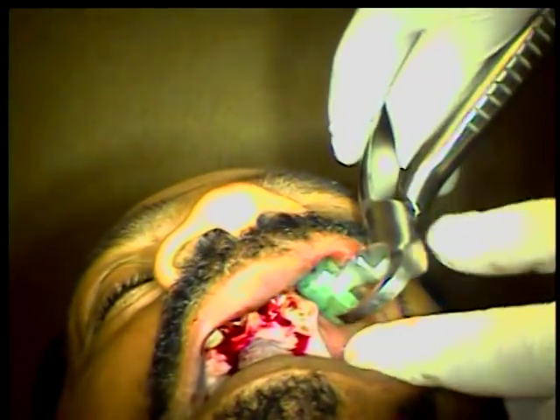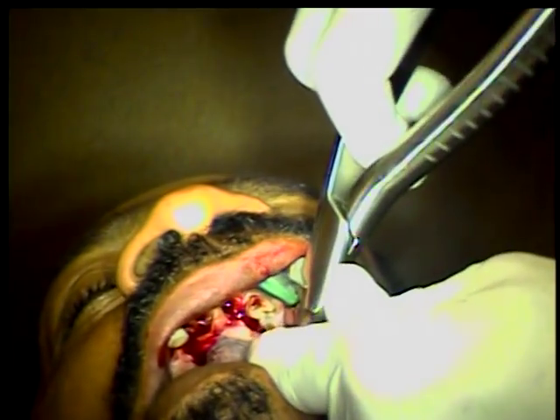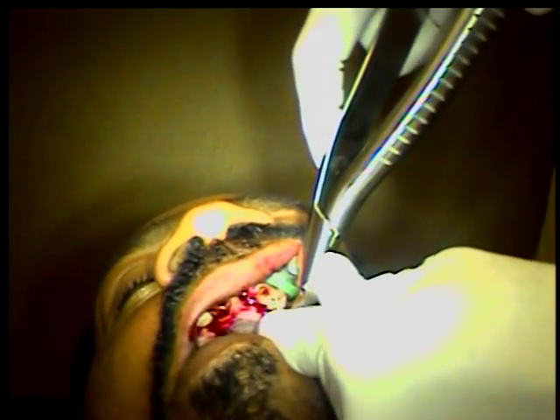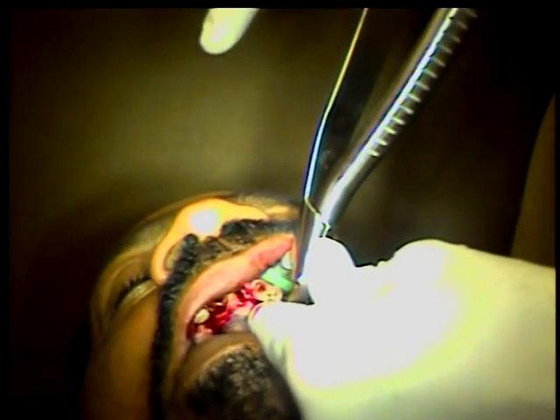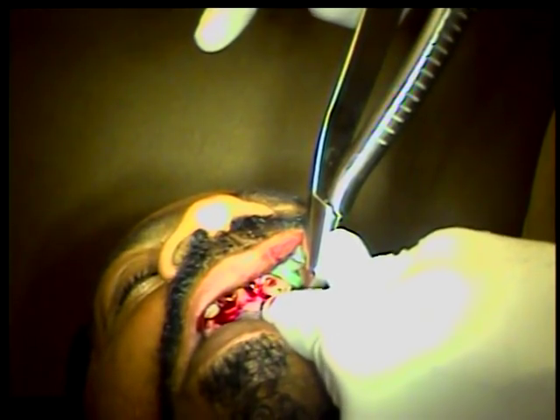Let's go to number twelve — same thing. Push down. I can use two fingers on this too, because I'm bracing the beak with my other hand. I'm using two fingers. All my wrist. The tooth is out.